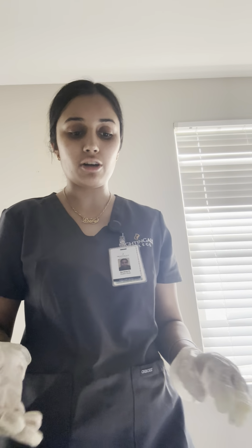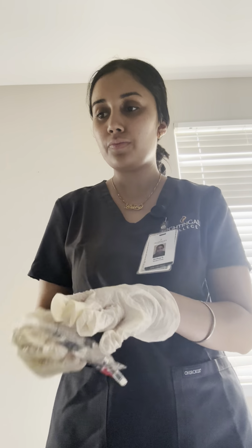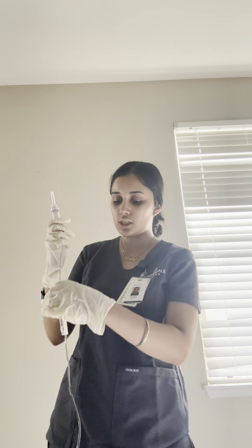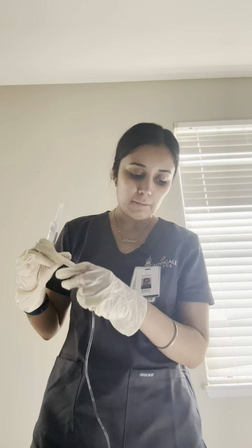And then before I begin this procedure, I would just like to go over the materials that I have. So I have my primary fluid bag right here. I have my secondary fluid. I have the primary fluid tubing. This is a spiking that will go directly into the fluid bag. This is a drip chamber in which I'll be able to visualize the amount of fluid that's in there. This is the tubing in itself. This is what you would inspect to make sure there's no air bubbles. If there are any kinks, you would want to fix that. And then we want to make sure it's clamped for now.